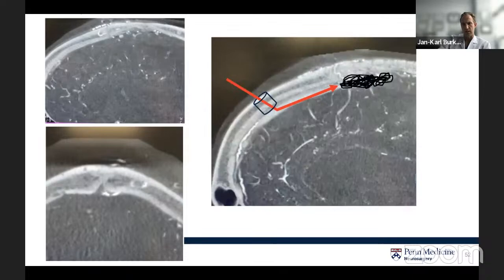So our idea was, since it was challenging to get an arterial approach here with multiple feeders, and the sinus was occluded, which was challenging to reopen and come from the back, especially since the whole segment was completely occluded, to do a small burr hole approach and then an endovascular coil occlusion of that sinus.